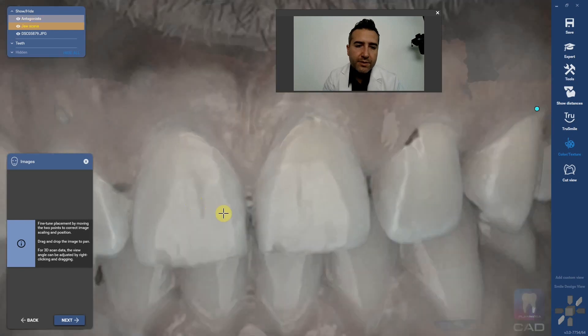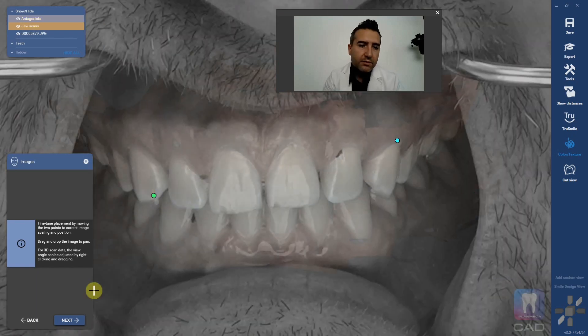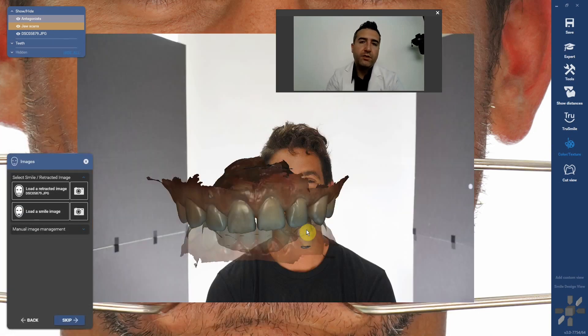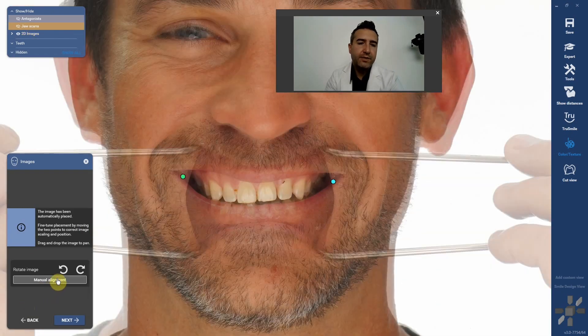So we're looking for — especially in the front six — everything to be perfectly coincident. Now we're going to load the smile image, and we're going to pin the smile image to the retracted. It's important that the patient doesn't tilt their head between those shots. I do the retracted first, then I just tell them take out the retractors and smile without moving your head. The software tries to pin the retracted to the smile automatically, but I never trust it.